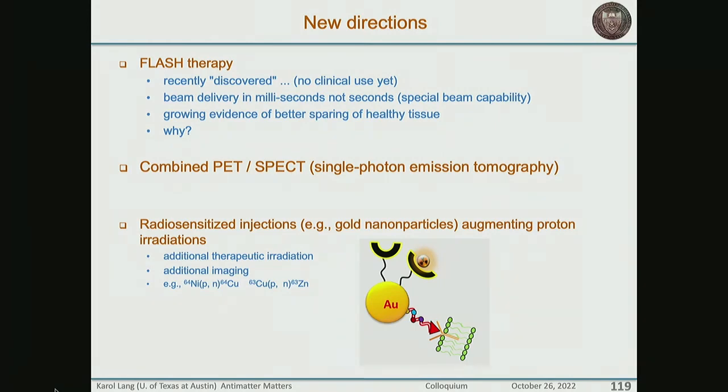So I have a hope that by arguing how one could improve monitoring in the context of FLASH therapy, you can actually introduce that monitoring. This is sometimes called image guiding or imaging guidance of therapy.